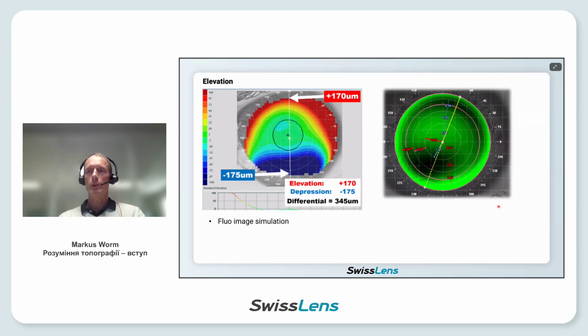Every fluo image simulation that you are doing is based on heights. The dark or even black areas showing very small differences between the back surface of the lens and the cornea means small differences in heights, whereas the bright green areas show pooling, so a lot of height differences.